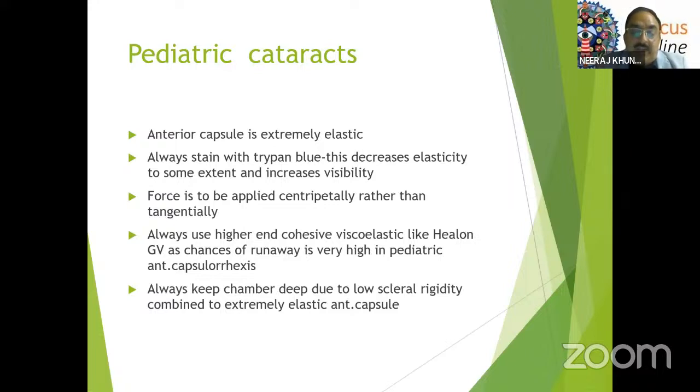Always keep the chamber deep. It should not be too deep. It should be adequately deep, but it should not be too deep because that also creates a problem due to low scleral rigidity combined with the extremely elastic anterior capsule.